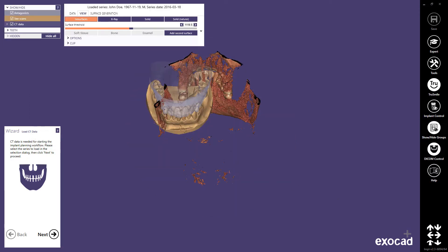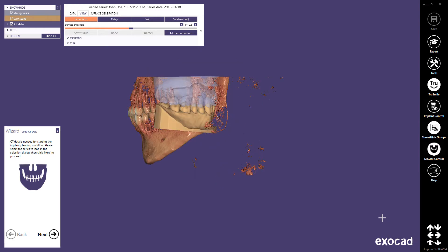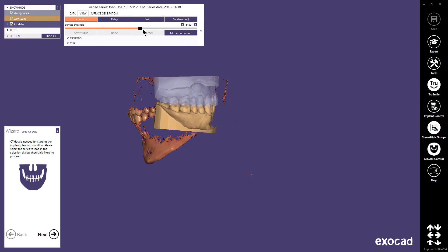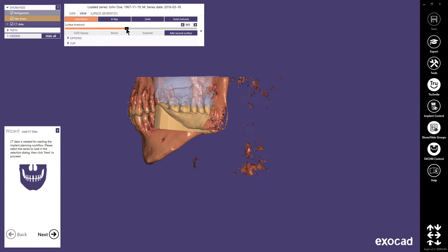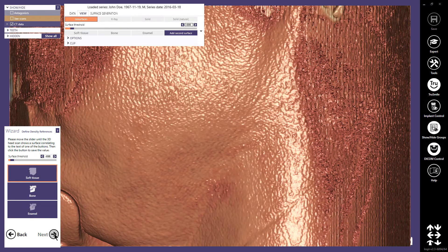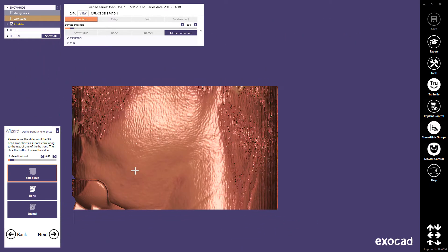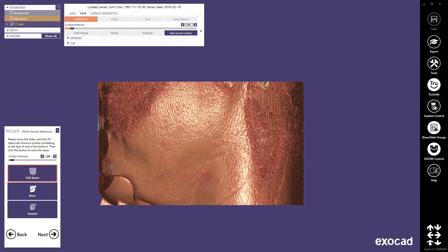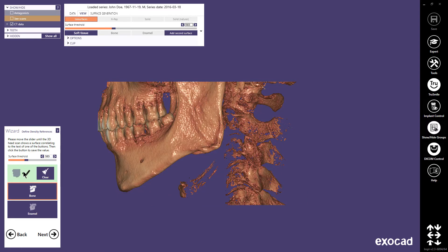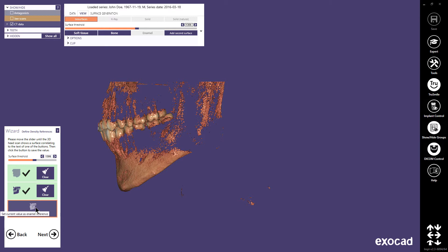At the top of the screen, the DICOM control is open. With the DICOM control, you can decide how to view your DICOM data. The details of the DICOM control will be explained in a separate video. In the next step, I can define the surface threshold for soft tissue, bone and enamel by moving the slider and clicking the corresponding button.